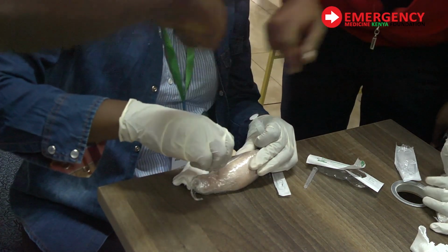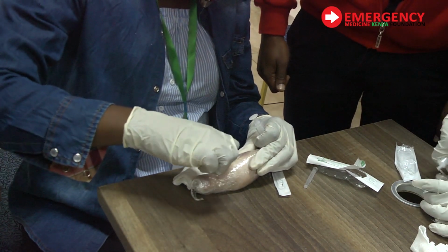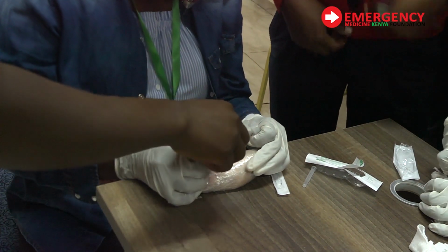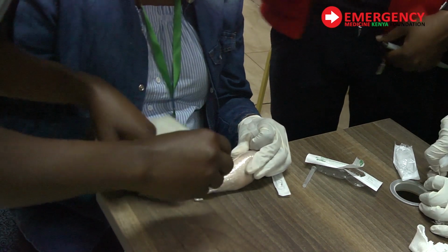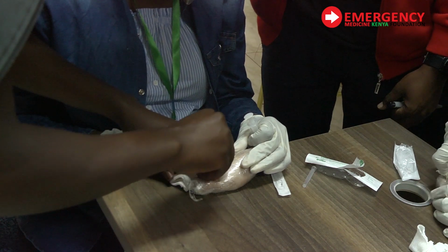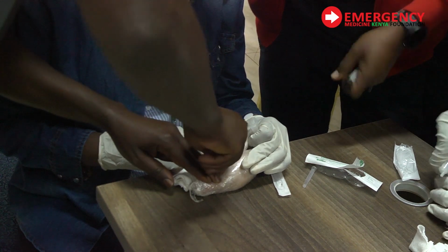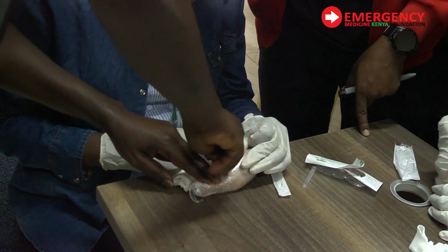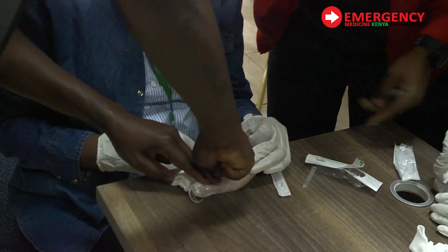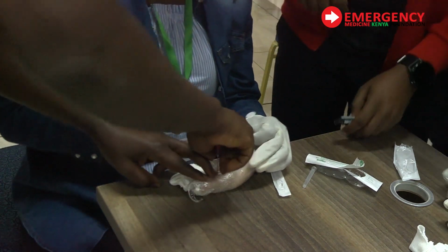Good. You need a needle? It's a needle. It doesn't slide on the bone. Great. There you pull out. Congratulations, you're doing well. There is a sharp box just next to you. Have you seen it?